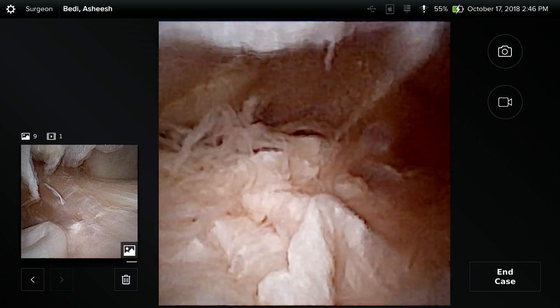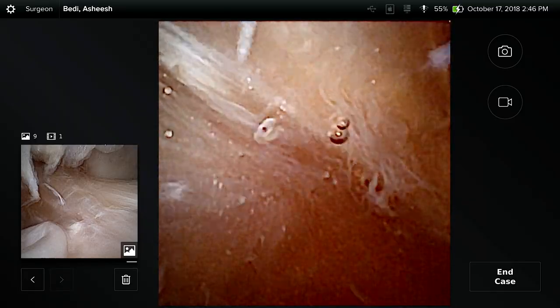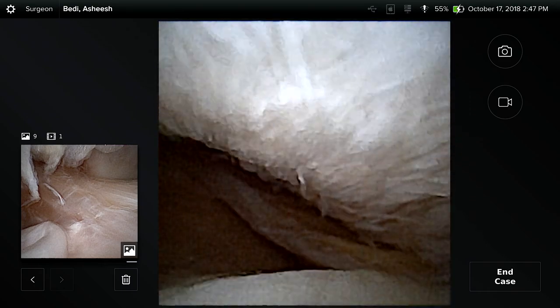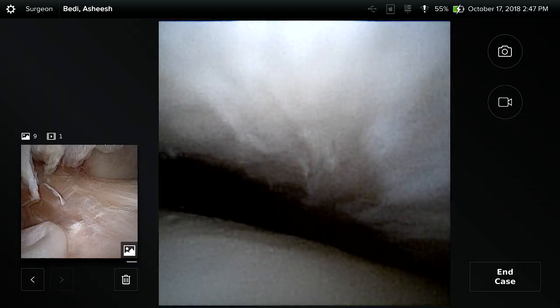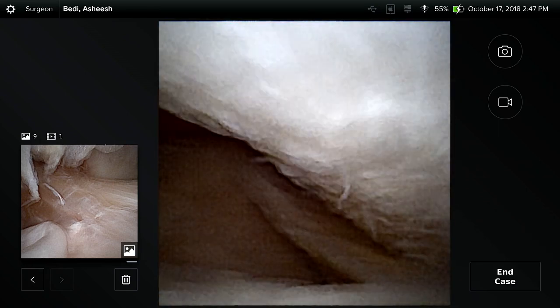Now we've accessed the suprapatellar pouch and the patellofemoral joint from a standard supralateral portal just distal to the vastus lateralis. You can see a great view of the suprapatellar pouch as I drive into the medial gutter. There is your patella with chondral disease. As we work a little distal you can see a good view of patellofemoral tracking — there's actually a plica entrapped between the patellofemoral joint. Flexing, you can actually watch the patella track along the trochlea.